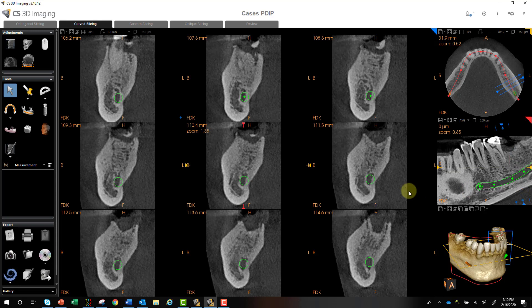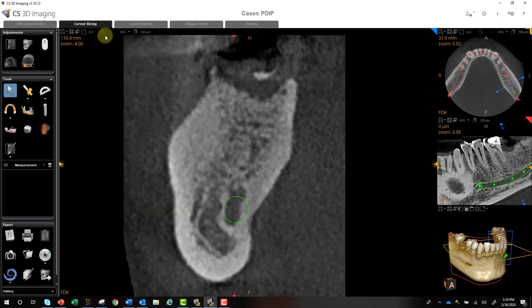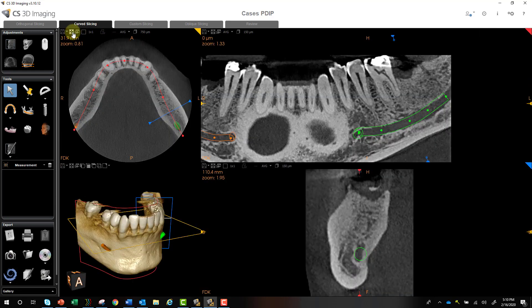This is a much better view to evaluate the entire space. If you're looking at just a 150 micron slice, you don't know what's happening two millimeters to the mesial or the distal. Maybe there's a root tip, maybe there's pathology you should be concerned about before placing an implant. So you want to be conscious of evaluating the entire area and not just the native resolution of that particular scan.